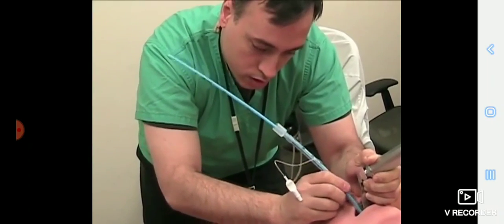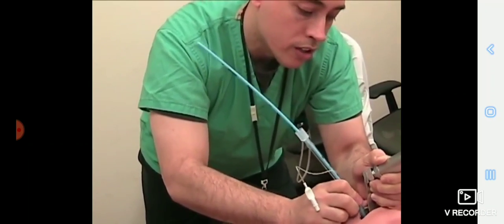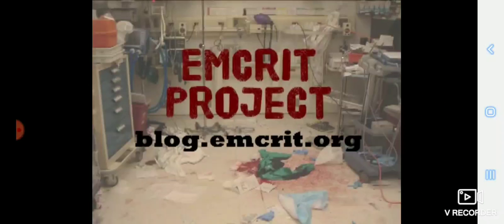So eventually the tube will start passing. You go in to about 22 or 23, take out your laryngoscope, take out your bougie, and you confirm your endotracheal tube.